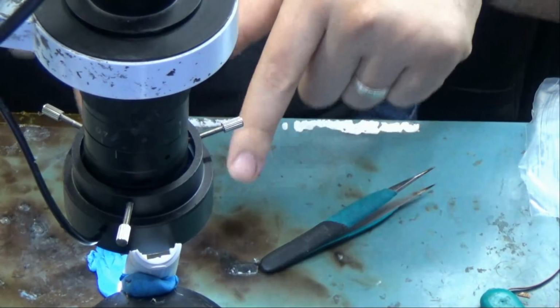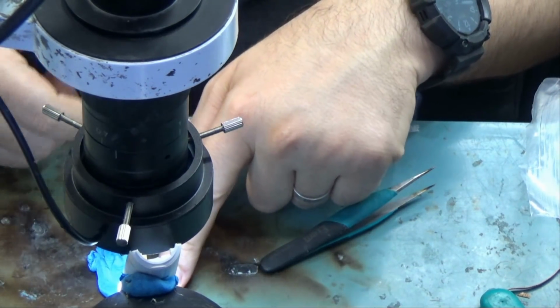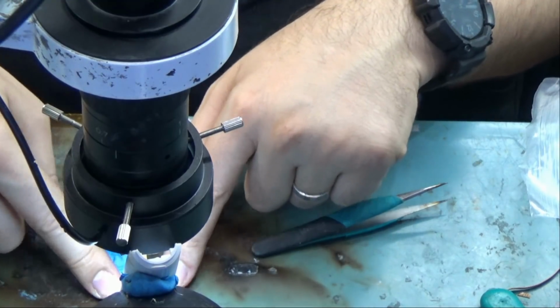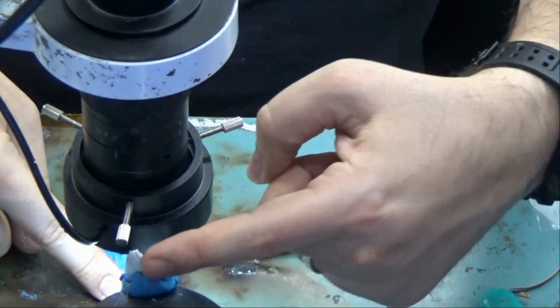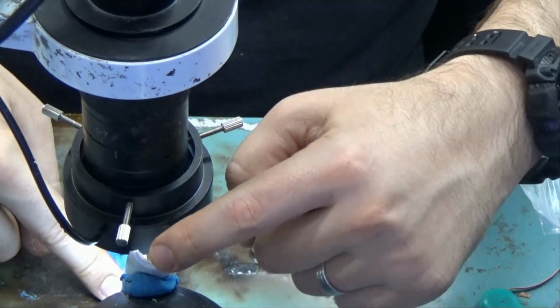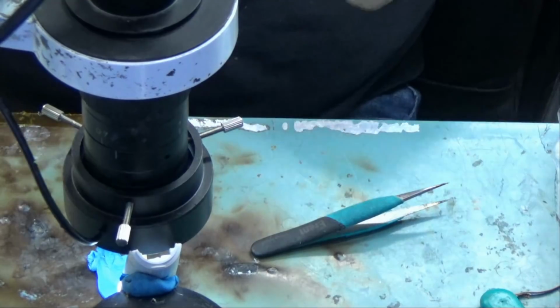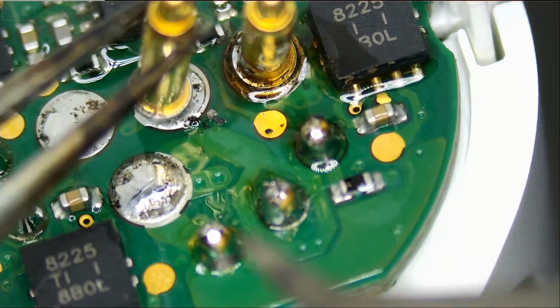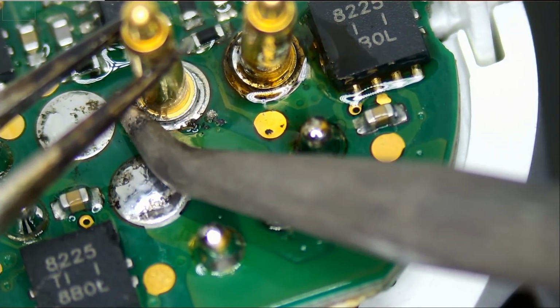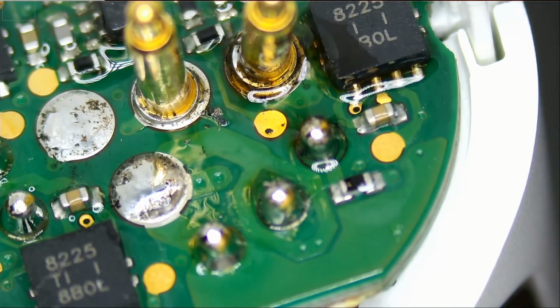Now what I did to further secure that tool so it does not wobble or fall down is I used blue tack. It's like a Play-Doh. I put some on the bottom here and some on the top here. So that motor or that device is not gonna move, or it's gonna have as little movement as possible. Okay, and the pin is solid. Let's solder pin number 3.